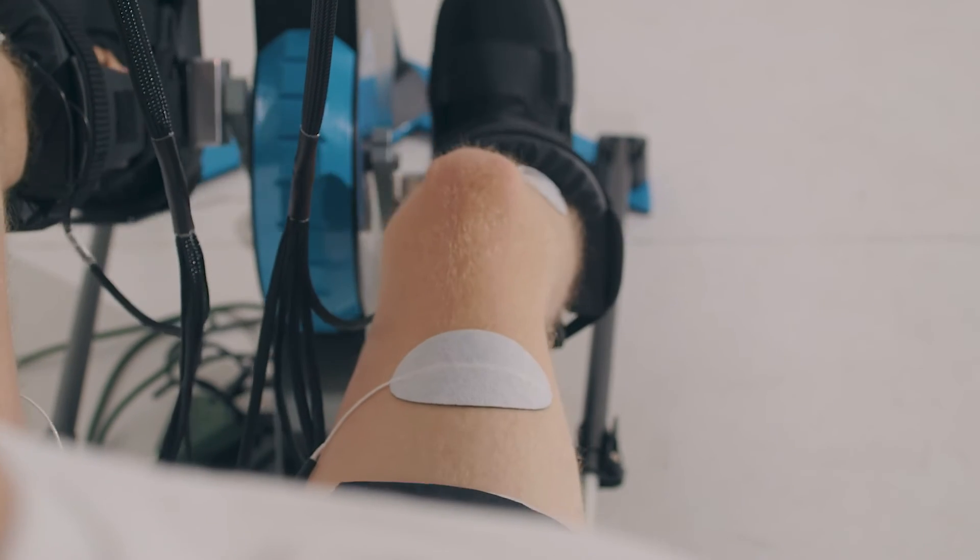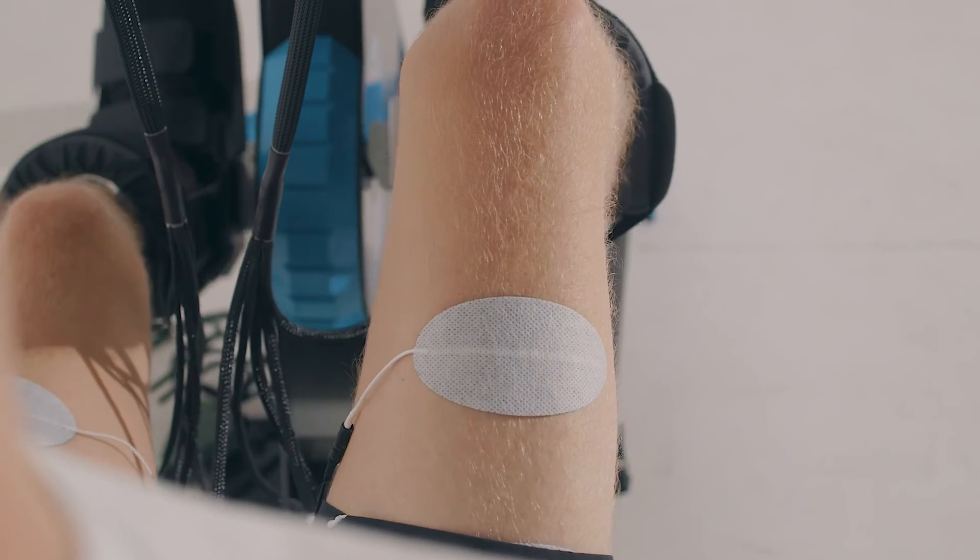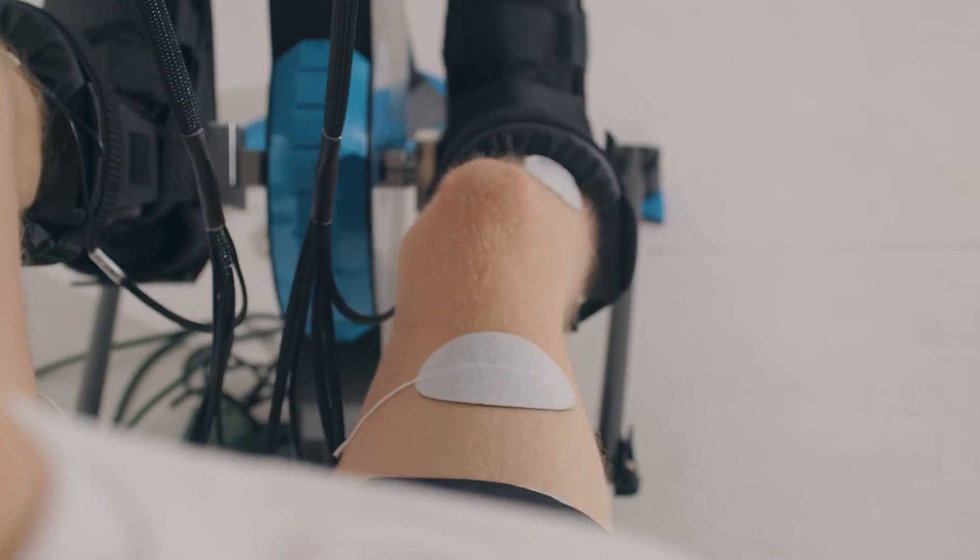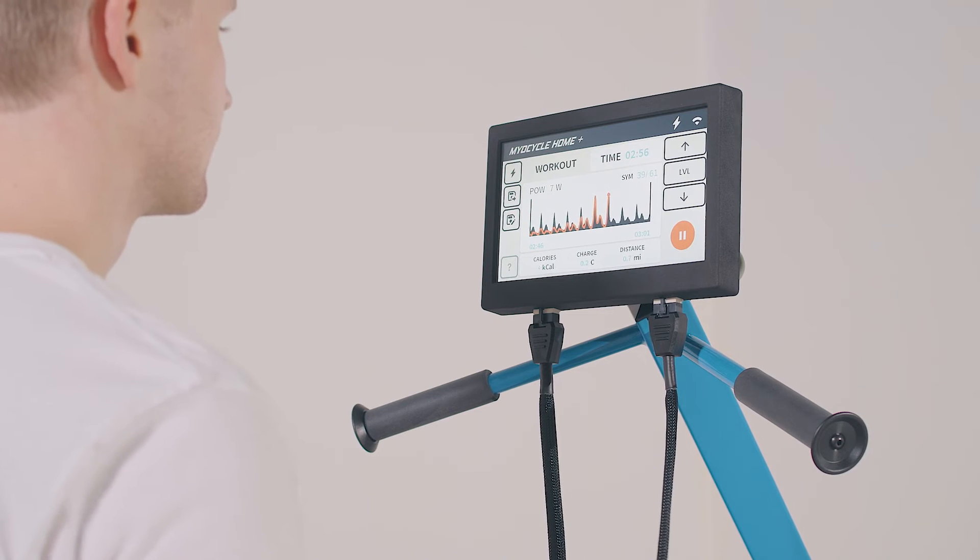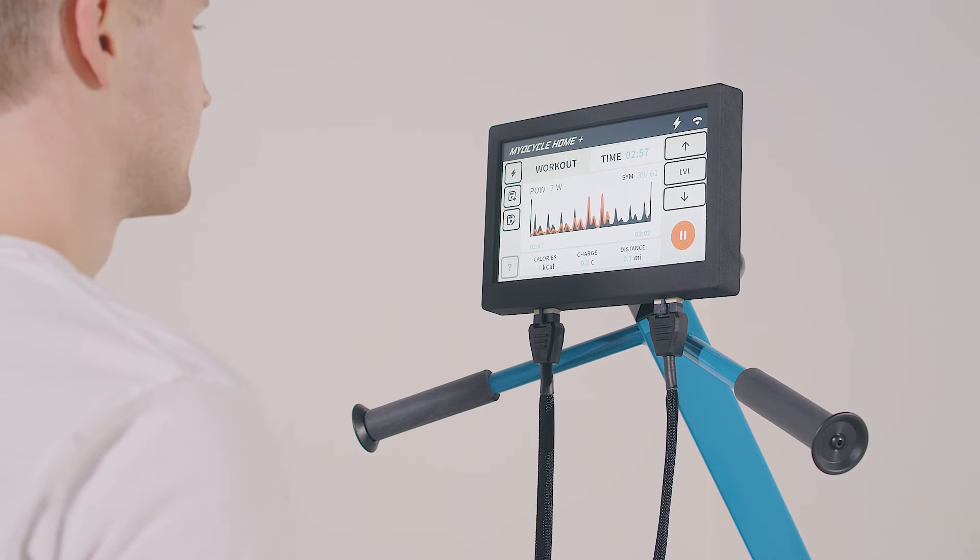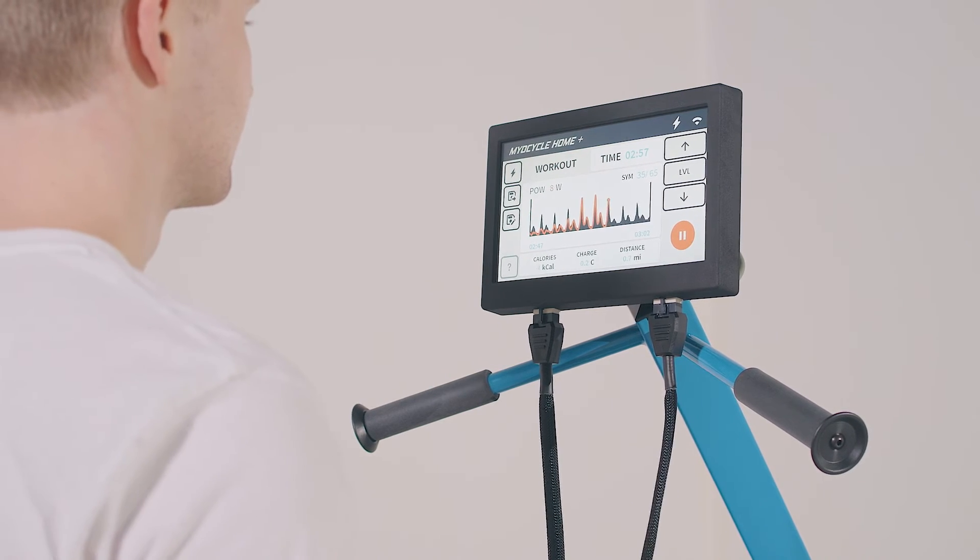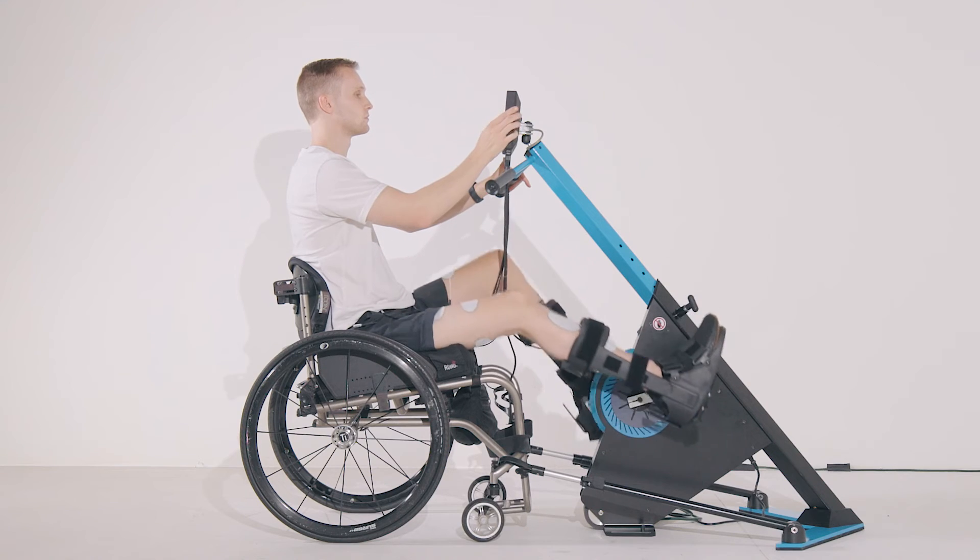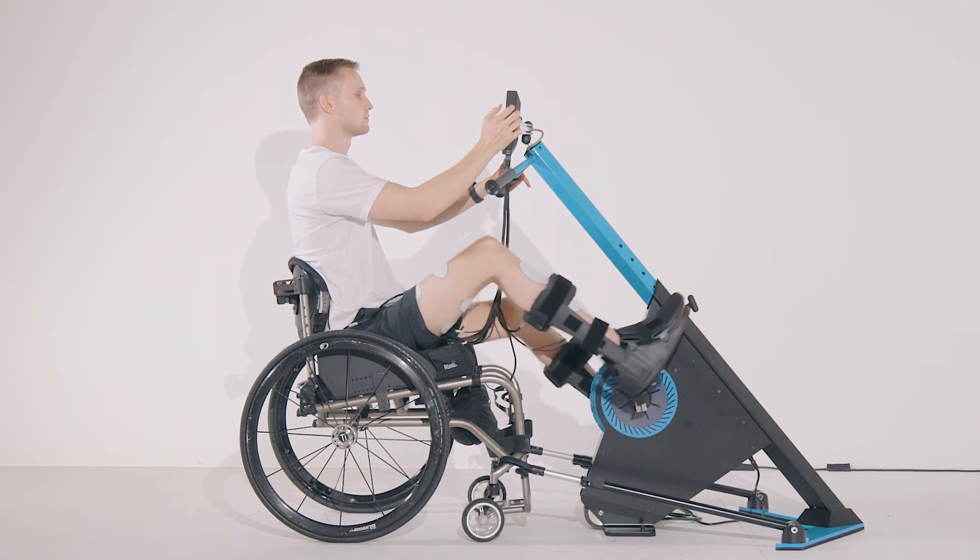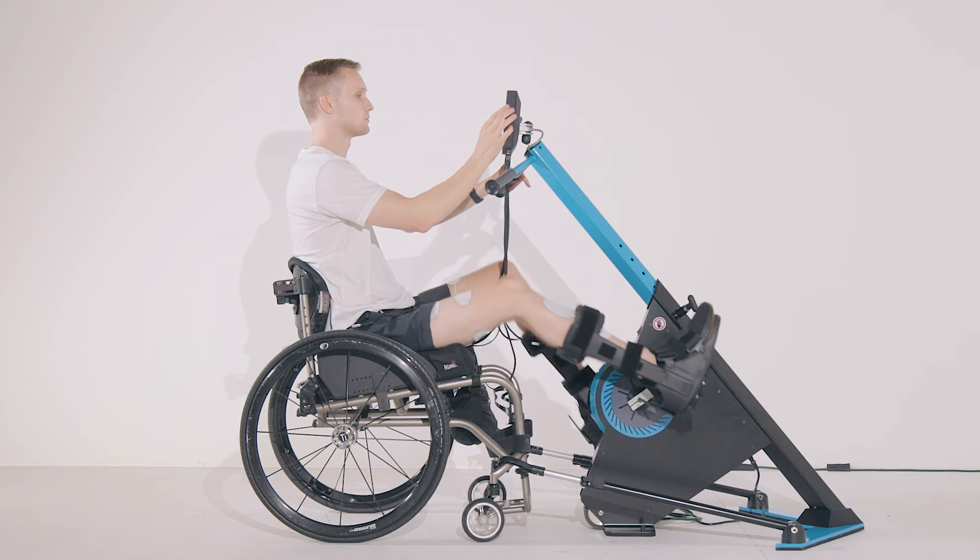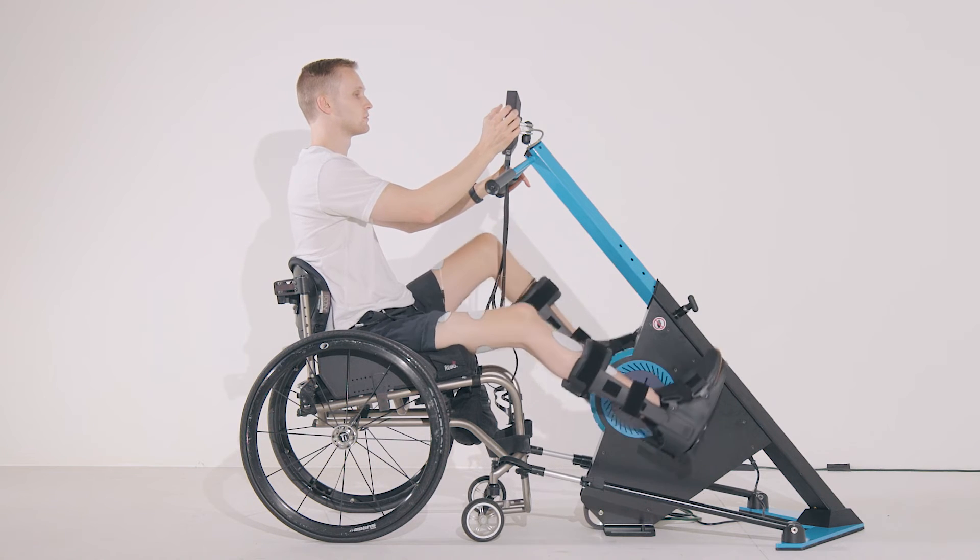When muscles are contracting strongly enough, your power output will start to rise. The goal is to raise your power output as high as possible and keep it there throughout the session. Remember, whether you can pedal on your own or not, try your best to pedal. Every bit of effort counts. Doing this consistently will maximize the benefits you gain from your myocycle.